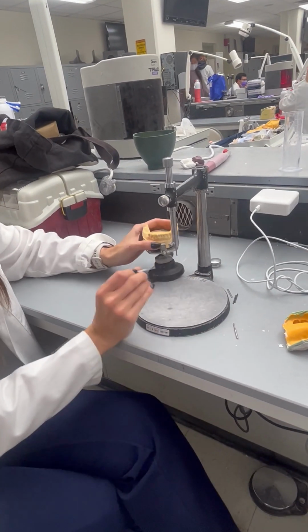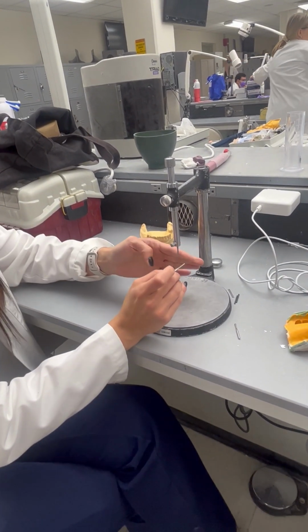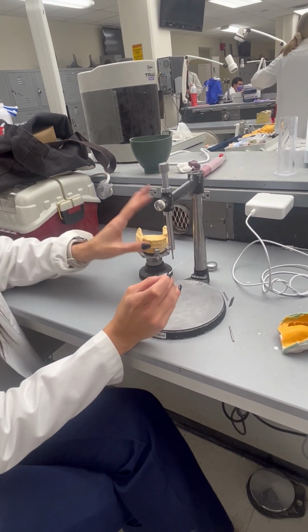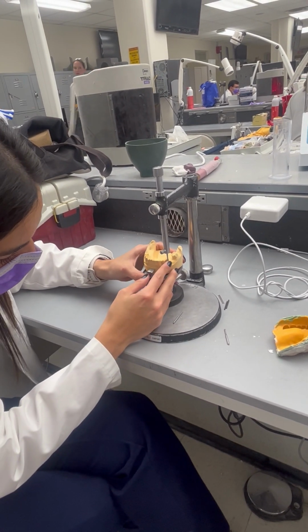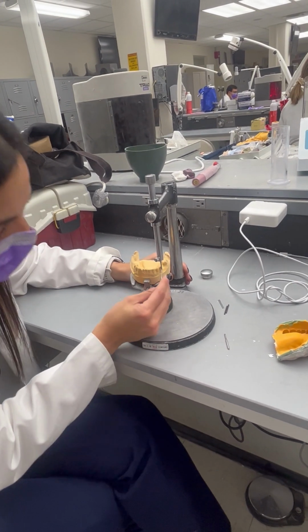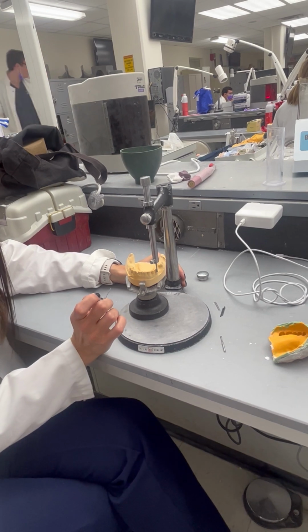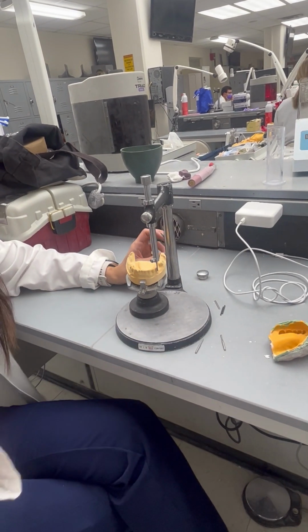So I'm looking that this is touching the height of contour and also the tip. If I put it against the tooth in here, I'm looking that I'm making a small triangle from the height of contour and that tip. Those are the ones that you're going to mark.